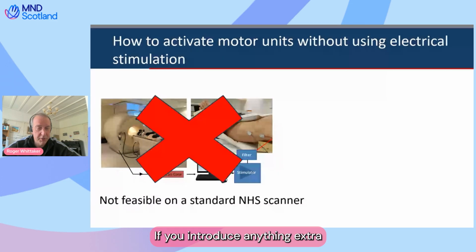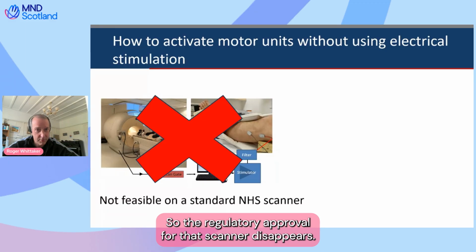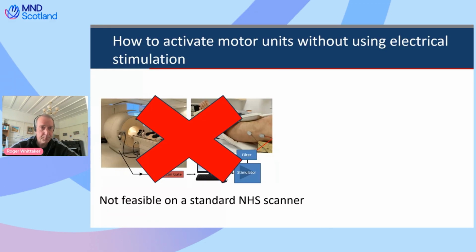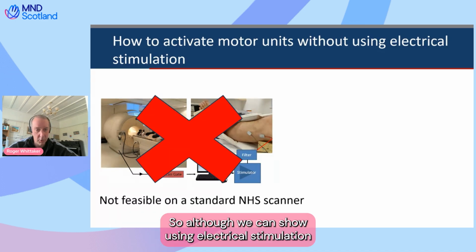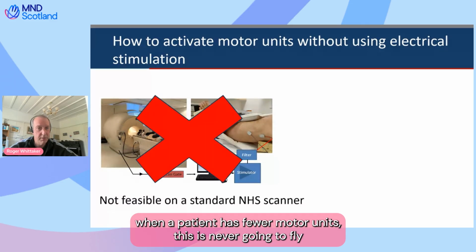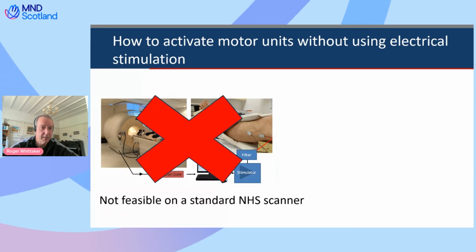If you introduce anything extra to the MRI scanner in the clinic, it breaks the CE marking. So the regulatory approval for that scanner disappears. And also just having wires and extra pieces of equipment in a busy NHS scanner is just not feasible. So although we can show using electrical stimulation when a patient has fewer motor units, this is never going to fly as a clinical tool to be used in the NHS.